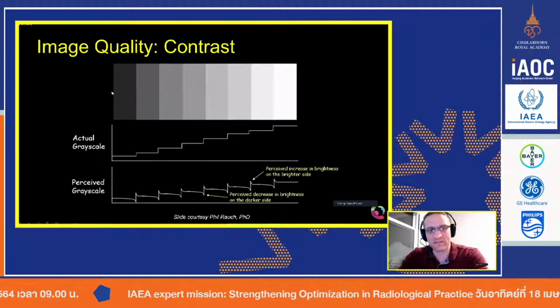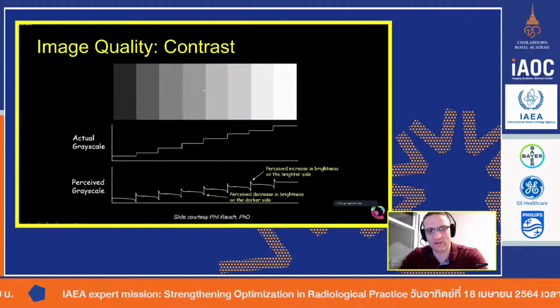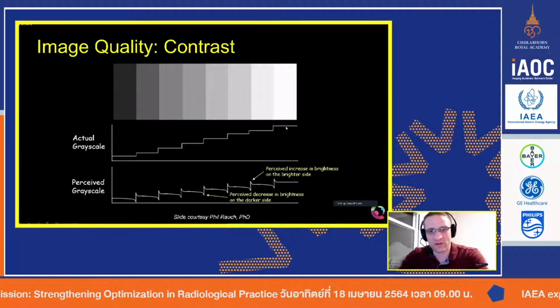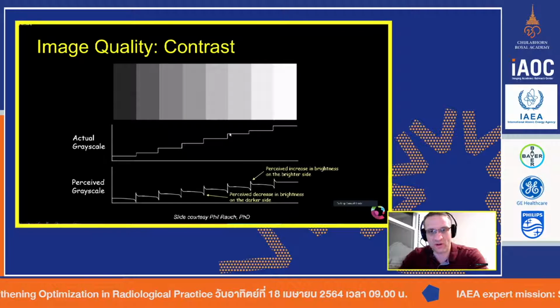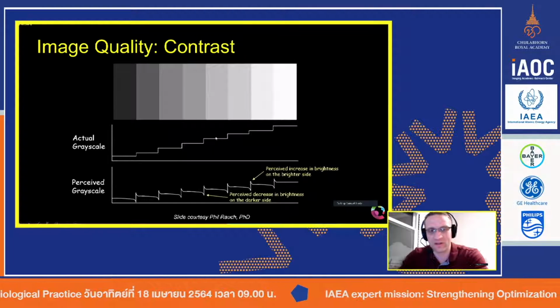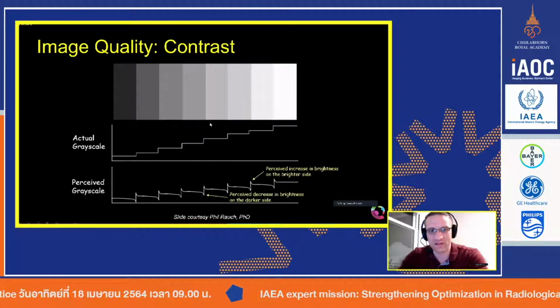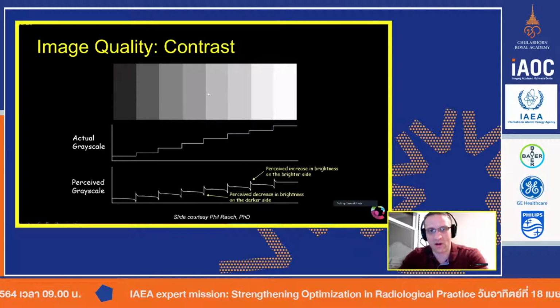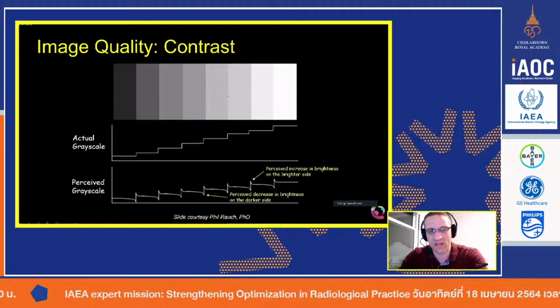If I measure and sample each one of these using the computer, I see these nice, strong edges. Obviously, I'm transitioning from one grayscale to another grayscale. There is no gradient. It's one value, then another value, and each of the values is 100% uniform from edge to edge.